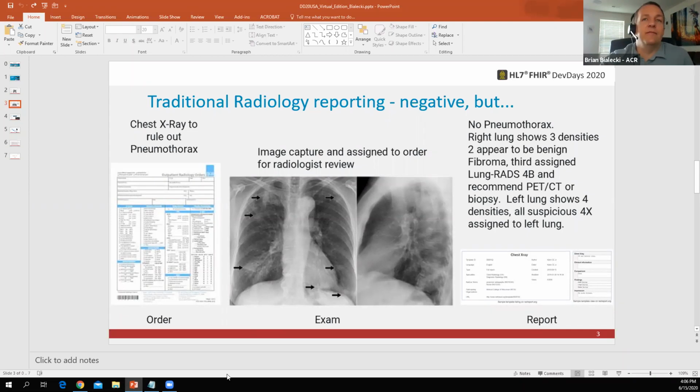In breast imaging, if I'm asking for compression of a certain mass, you want to make sure that particular item is actually looked at. And this is why the breast reporting was easier to get it into. It made sense at the time, but there are lots of use cases where this is available.